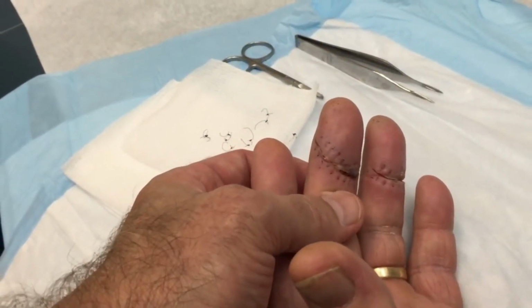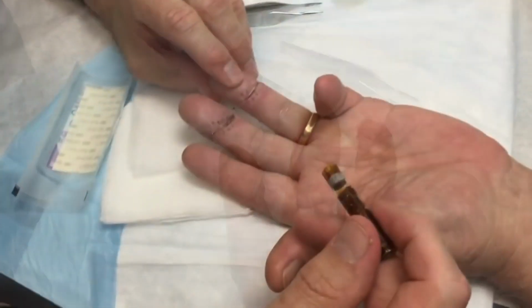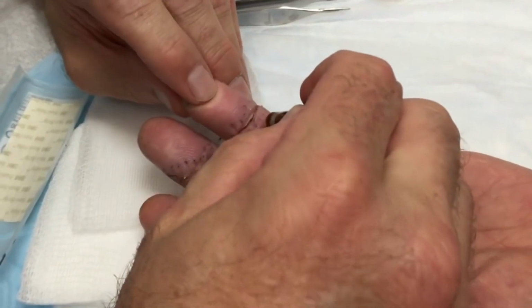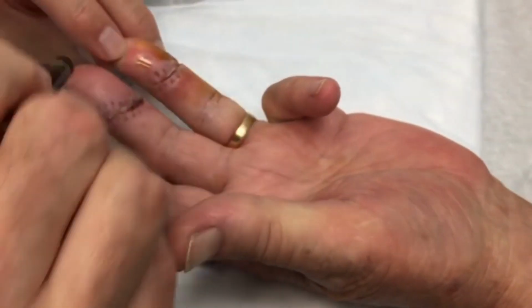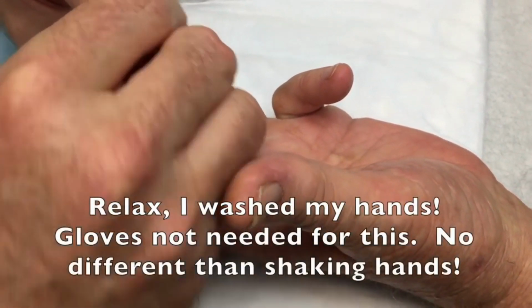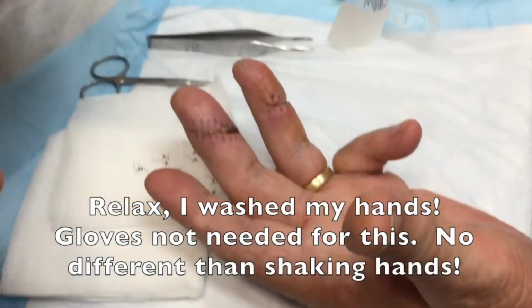This one you're healed. We're going to do dressings on it. This one we need to steri-strip. See, this one here did not heal very well. So we're going to go ahead and use a little tincture of benzoin. This is the sticky stuff. What does that do? It's sticky. It's going to make your fingers sticky, so these little strips here will hold on better.